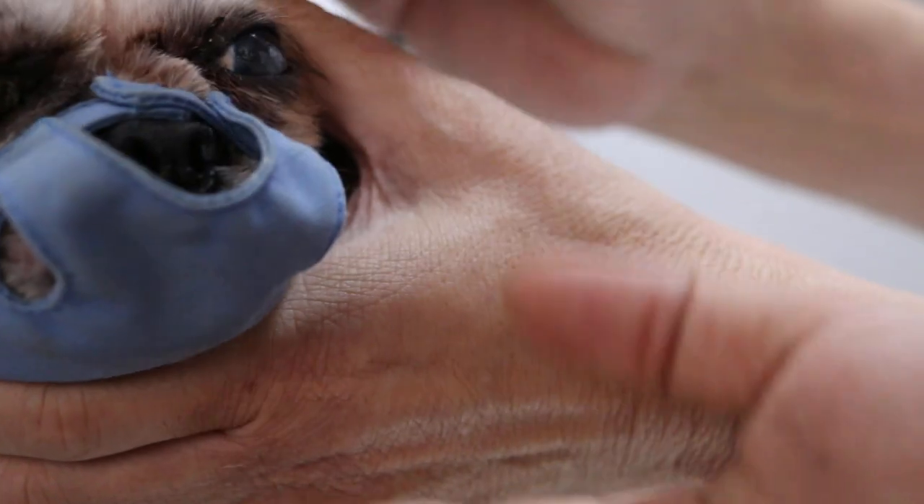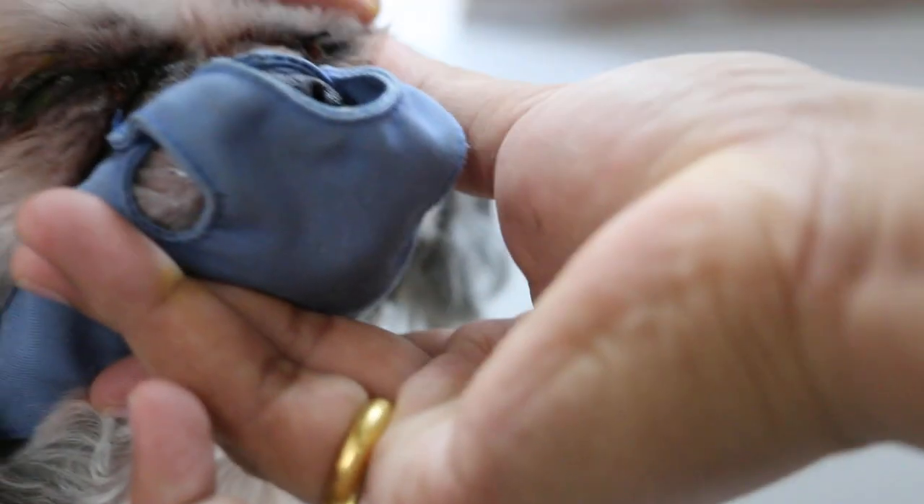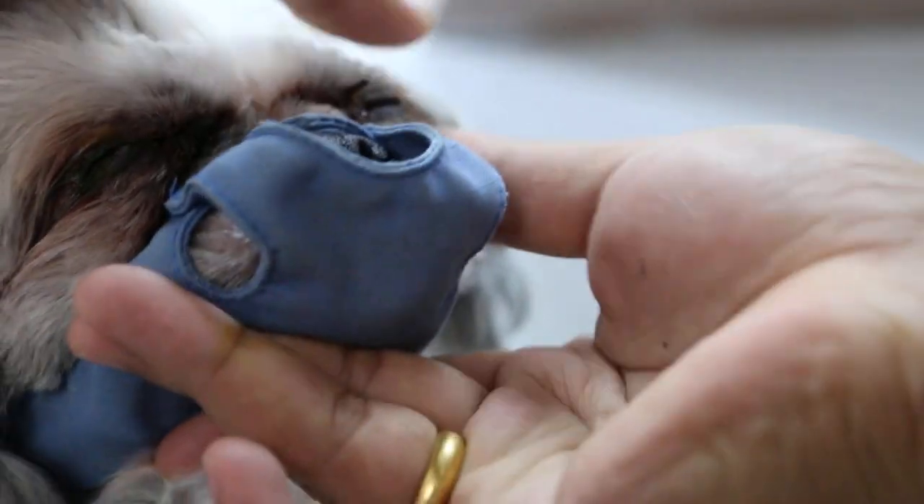Come, open up first. You can see the ulcer — just put one drop. If there is no ulcer, it will not be green color. If there is an ulcer, it will be green color. And that is to show the owner.